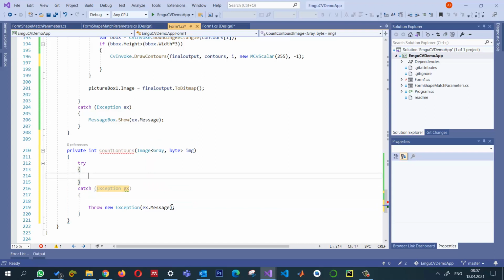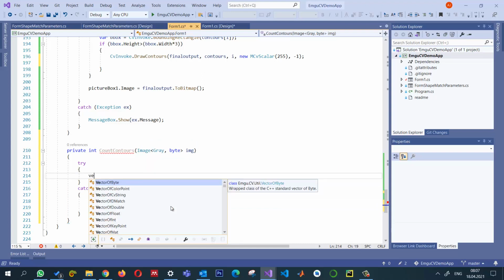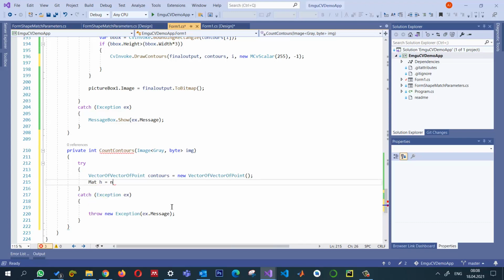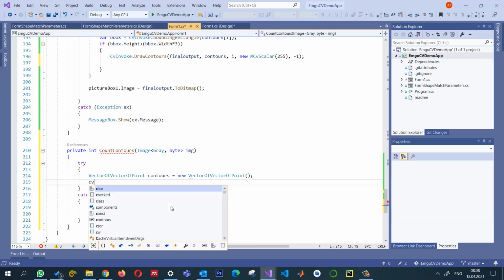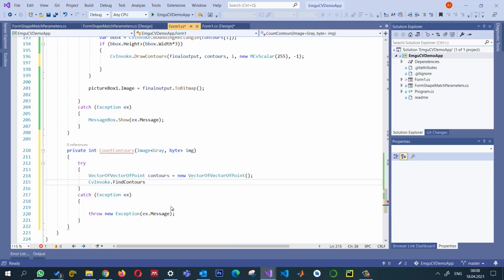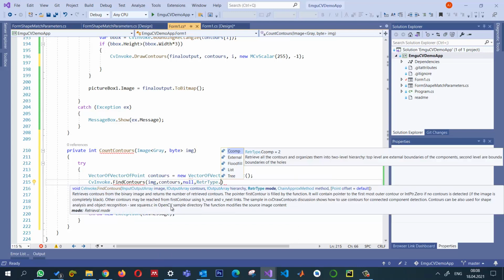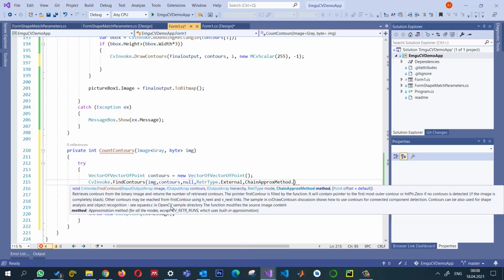Okay, and here what I will do is, again I will calculate the contours, a vector of point for that image. We can call it contours is equal to new contours, and a mat to store the hierarchy, or in fact we don't need the hierarchy. What we can do here, CvInvoke.FindContours, and here we can pass the image, that will be img, and outputs will be in contours, and we are going to pass the null. I don't know whether this will work or not, so let's try. And I need only the external contours and a chain approximation simple one.